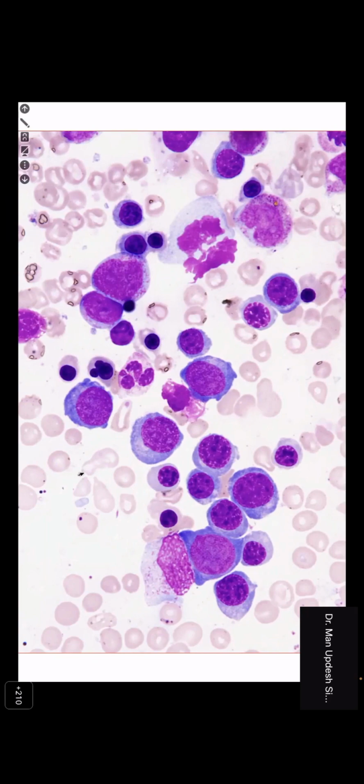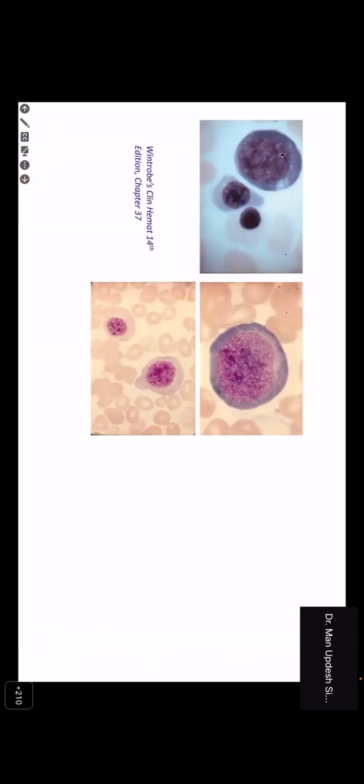And in any case, if you have confusion like this case, which is very recent, you can still give a trial of B12, right? So that's just a picture to show normal, early, intermediate, and late. That clump should be there with hemoglobinization. That's the early megaloblast. The late erythroid cell is showing opened up sieve-like chromatin, and the hemoglobinization is adequate. So that is how the megaloblast will look. If the megaloblastosis is severe, you stop seeing the late forms, and there's an arrest of maturation. You start seeing the earlier forms more often in the bone marrow.